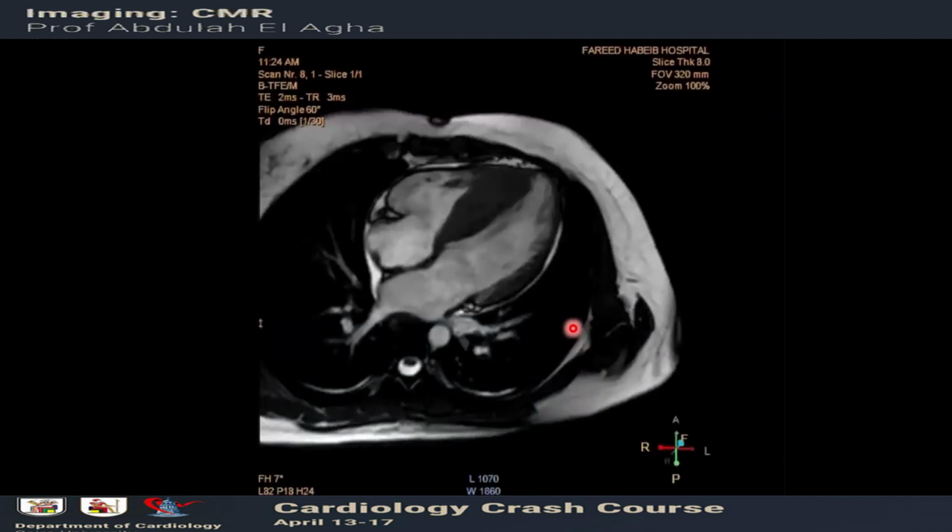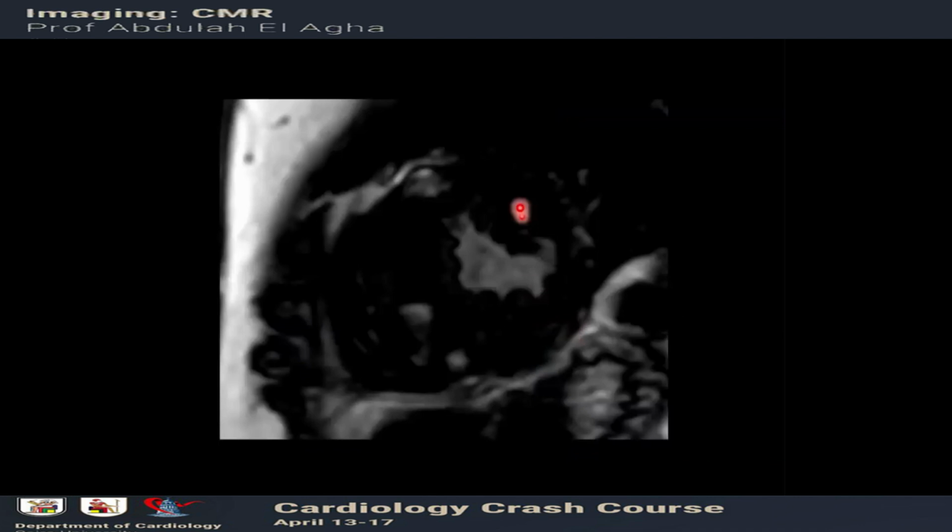Syncope is one of the major determinants. Do you put an ICD in a patient with presyncope? No, if the patient has the criteria, we're going to discuss it now in the following slides. So what we do here, actually, the indication was risk stratification of this HOCM patient.